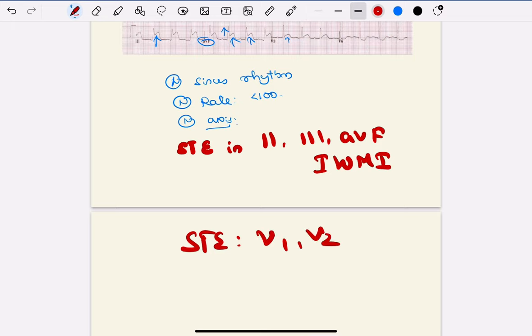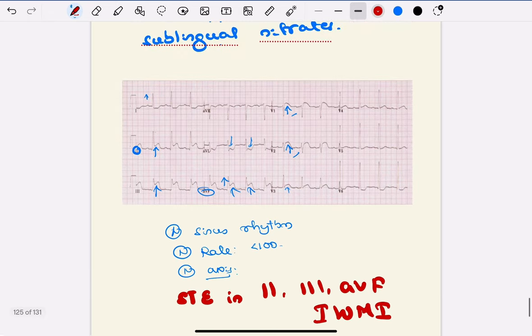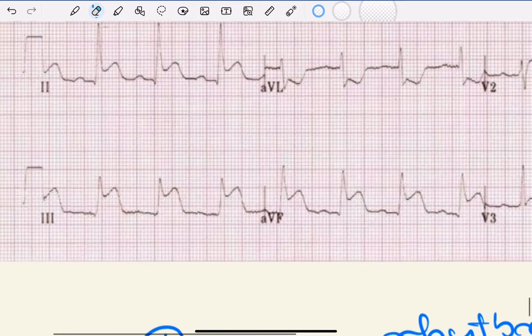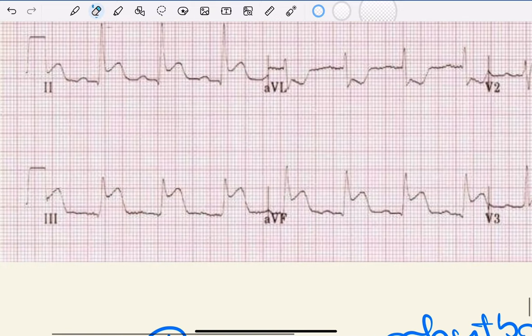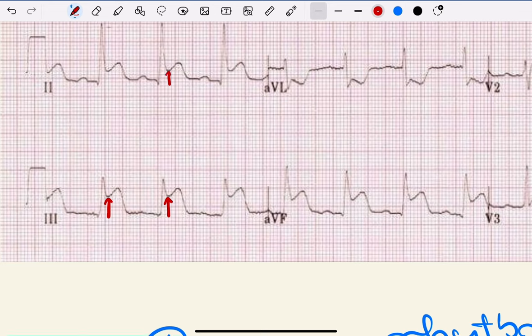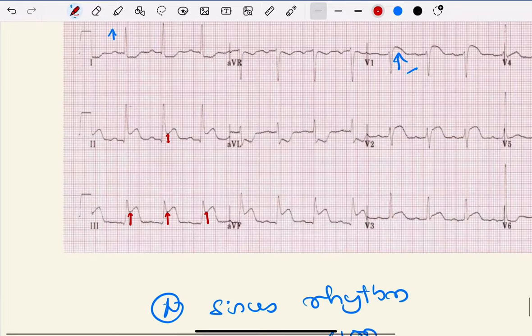If you look carefully, the magnitude or amplitude of ST elevation in lead III - look at this magnitude and compare the ST elevation magnitude in lead II. ST elevation in lead III is more than lead II. The magnitude of ST elevation in lead III is more than lead II.